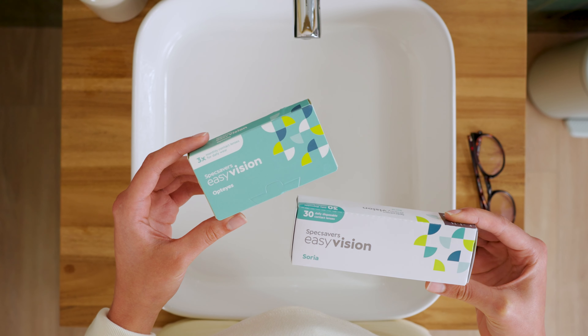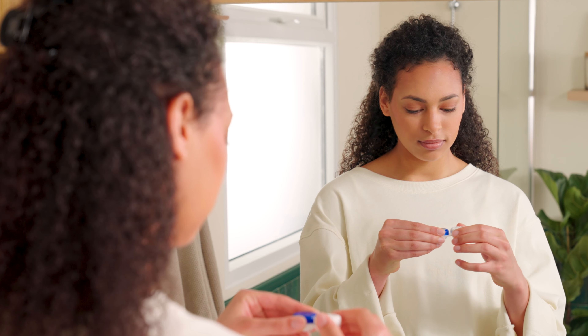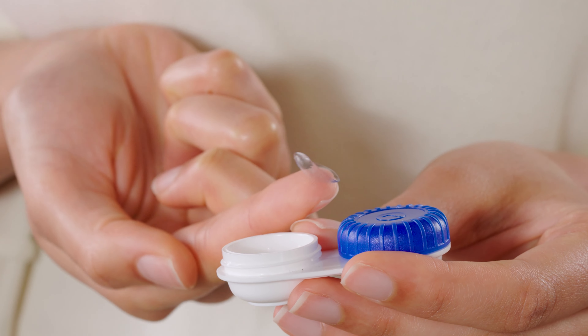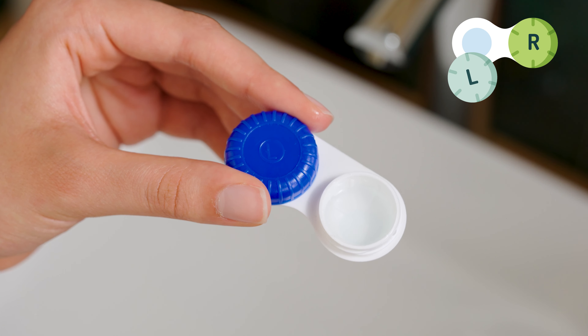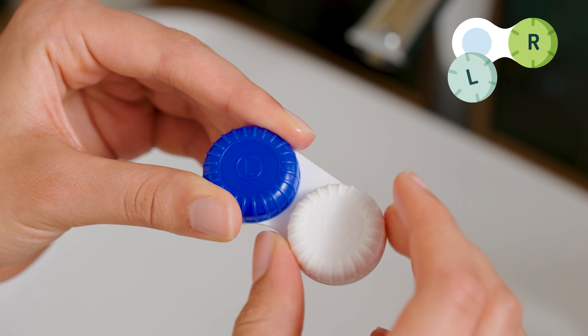Now, you'll either have daily disposable lenses or reusable lenses. Whatever type you're using, open the case or blister and with your index finger, scoop out the lens. Make sure you use the correct lens for each eye, as some people have different prescriptions for their left and right.